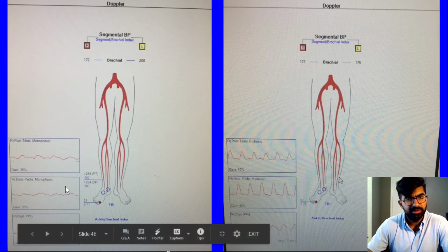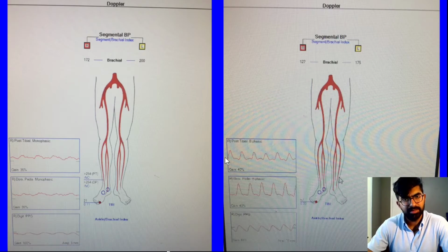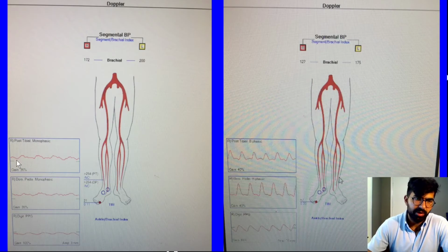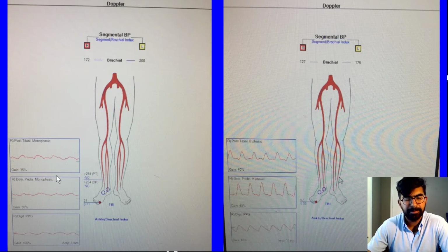Though it's a very distal waveform, you do see that after even the left to right femoral bypass, you notice a significant increase and changes in waveform. Again, the lower amplitude, increased time to peak, all points to an inflow lesion, which again was fixed with the femoral bypass.